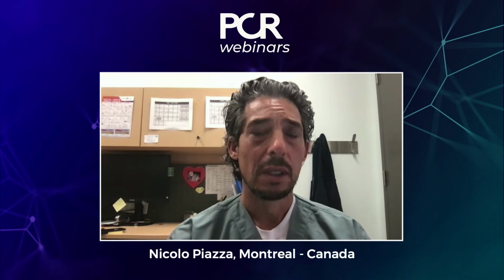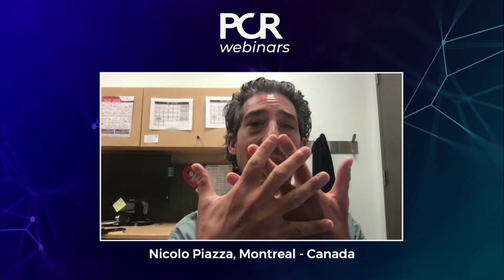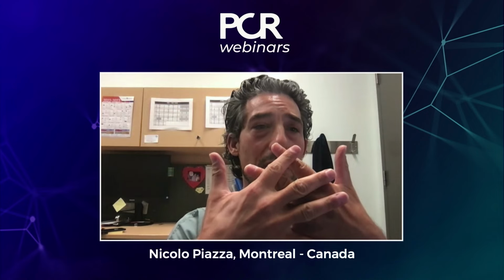Yeah, so of course, it's going to be the risk of coronary access. If you do have, for instance, an Evolut valve that fails, the idea of putting a second Evolut runs the risk of not only pushing up the initial prosthetic valve leaflets against the frame, but now you've got yourself caged with two frames. So it's sort of like a double whammy, and that's not good for coronary access. Although we used to do that in the past, that is not common practice anymore, and it should be highly discouraged.